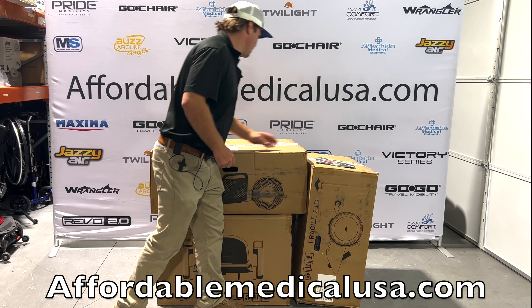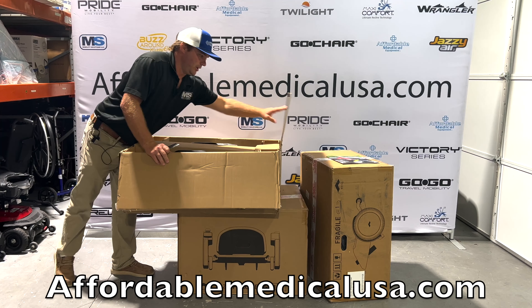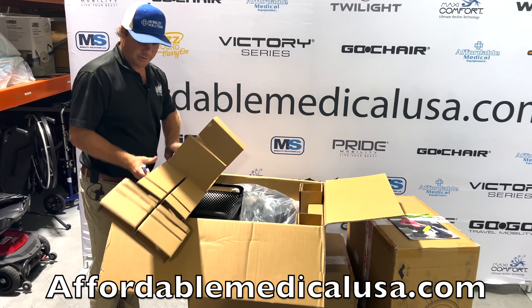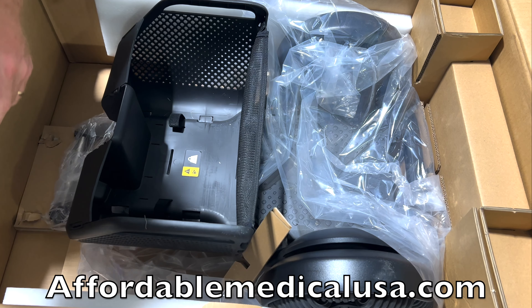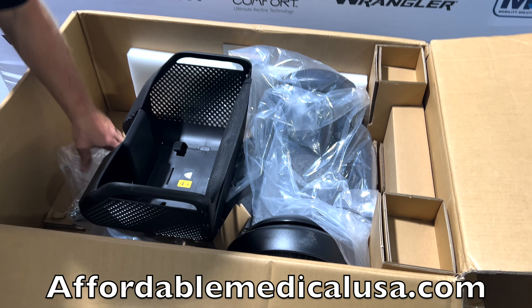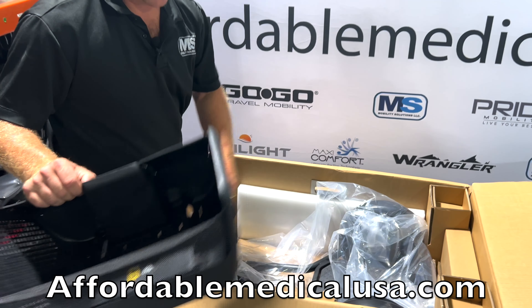The first thing I'm going to do is cut this box. If you want it white glove delivered, we can arrange that — just click on white glove delivery. If you had your grandson, your son, or yourself or your husband, it's manageable. We just drop-shipped one the other day and he texted me saying he got it and loves it — it's very easy to put together. We still want to do an unboxing video. This is the basket, a little mesh — we'll show you where that goes.